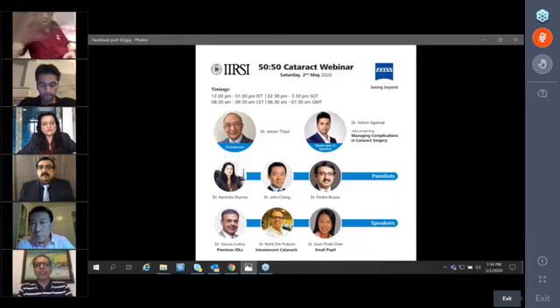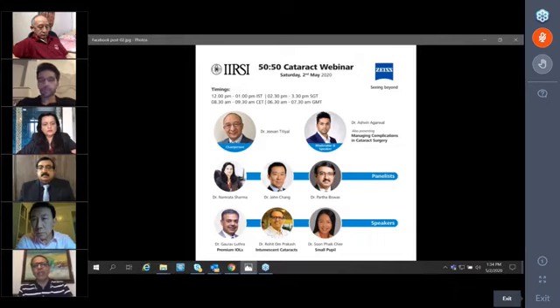If by any means the flap is everted and fluttering, this means that it is pre-equatorial. And the moment it goes beyond and becomes a wraparound tear, in other words a post-equatorial tear, it stops fluttering and becomes inverted. So this appears much before the classical signs of posterior capsule rupture. That is the end point where you should inflate and convert, and that is how we come to know the extent of the Argentinian flag sign.